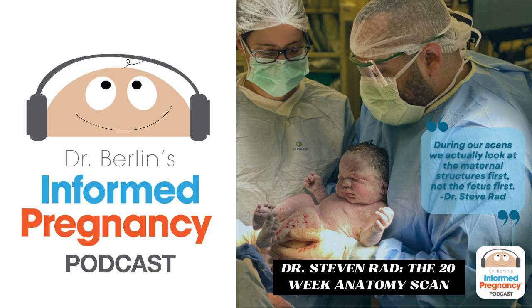Patients with a smaller placenta have a higher risk of fetal growth restriction, pregnancy complications, and stillbirth. And so that's something that we look at closely. Okay. So we have the cervix and the placenta, and then what happens next, and the umbilical cord?